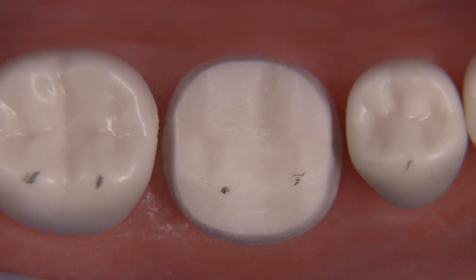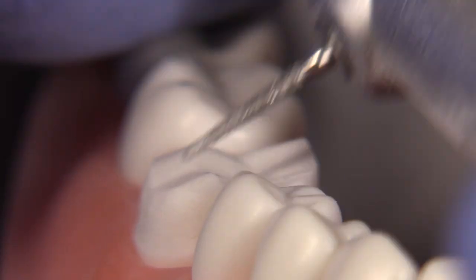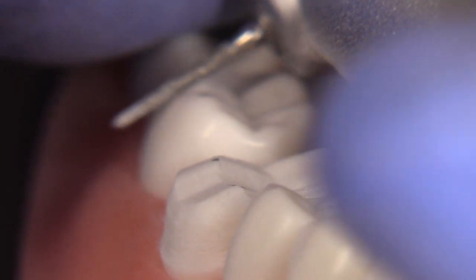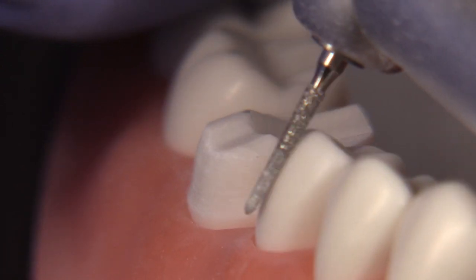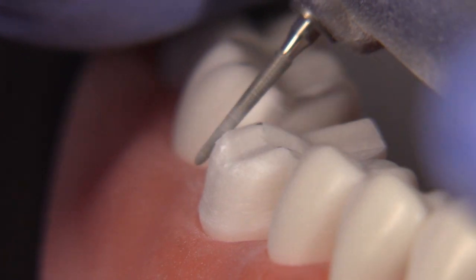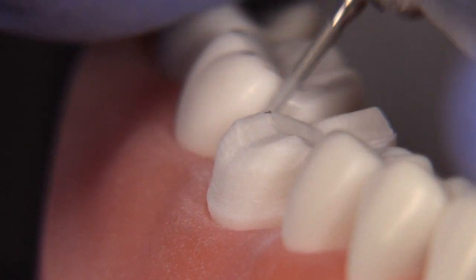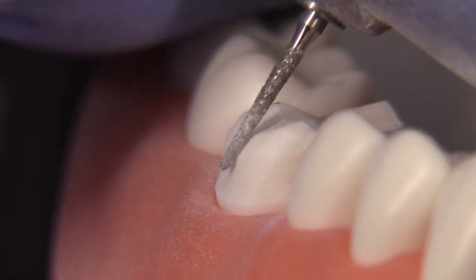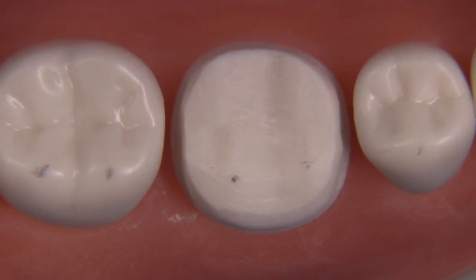We're definitely going to want a little bit more bulk for the metal on the lingual and for the ceramic in other areas, so we can get things a lot closer with the 878K012 by going around. When I learned this preparation I was never taught this — I was taught you had to do every step ideally, and I always felt that was just too difficult. It's nice to have this system in place where you can go back and refine things. This is the secondary plane, done for contour purposes and to ensure adequate thickness of the ceramic.